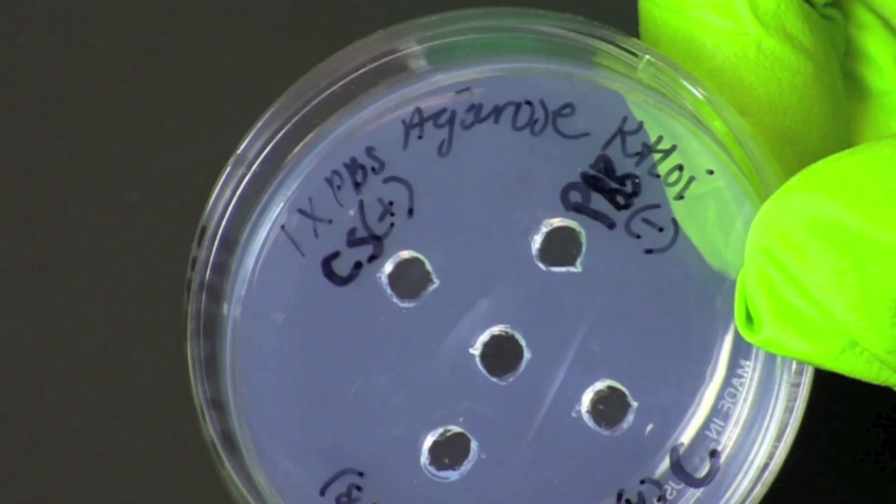Cover the petri plates and incubate at room temperature for 24 to 72 hours. Keep the plate right side up.